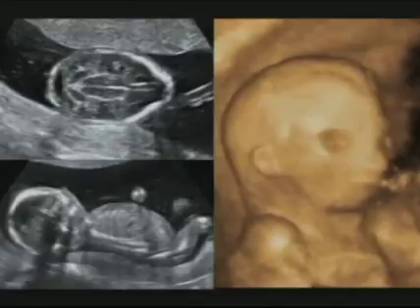And now with the 3D surface rendering, we can take a look at the face of this fetus. You can see the pointy forehead. Very funny looking ear here, a small ear, probably somewhat low set, because the ear normally comes up to about the level of the orbit. And it looks like there's also a small chin, micrognathia.